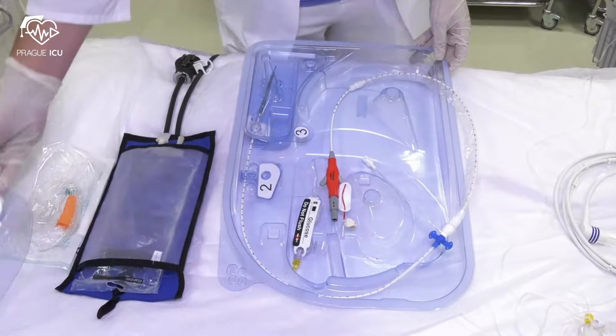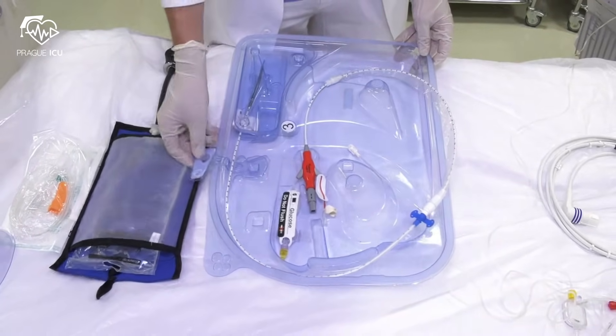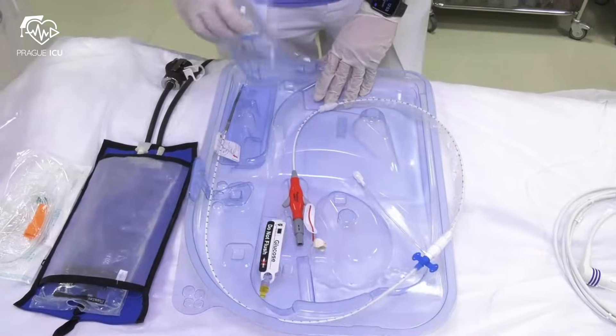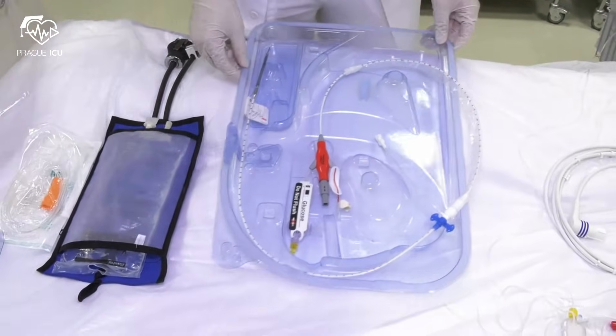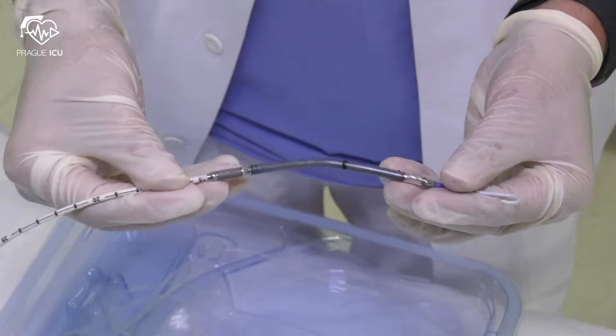You can proceed with unpacking the Impella catheter, following the numbers from 1 to 3. Here we can see the main components of the Impella catheter.